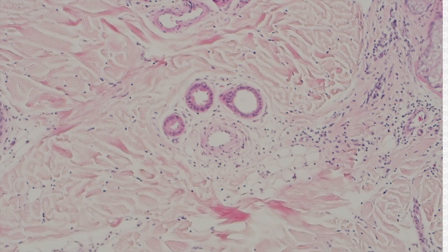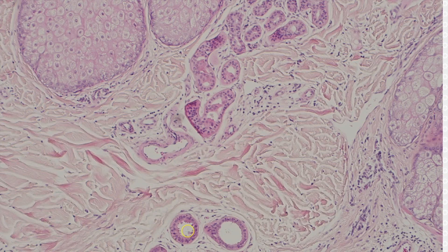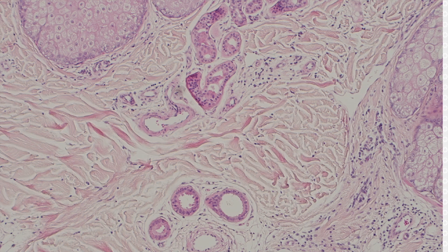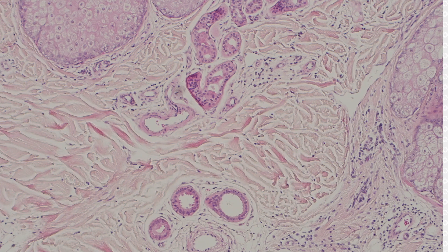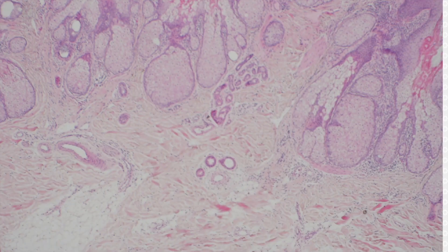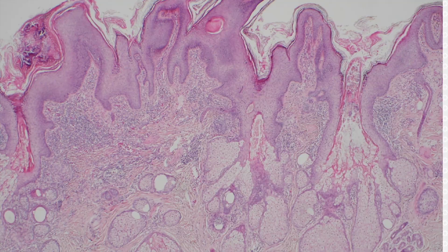In nevus sebaceous you don't always have full-blown apocrine glands; sometimes they have an overlap — they look like eccrine coils but with a little bit of that apocrine nuclear change or snouting, the decapitation snouts. Those are still called apocrine glands. Apocrine glands normally are found in the anogenital areas, around the nipples, and you can see them on the eyelid margin — the glands of Moll, which are modified apocrine glands. So if you see apocrine glands in the dermis on the scalp, you're probably dealing with a nevus sebaceous.